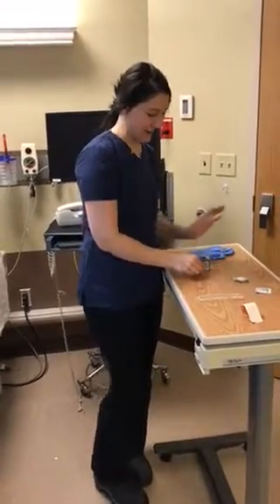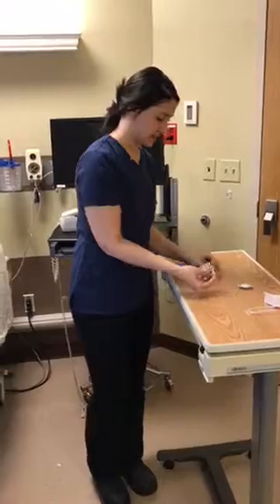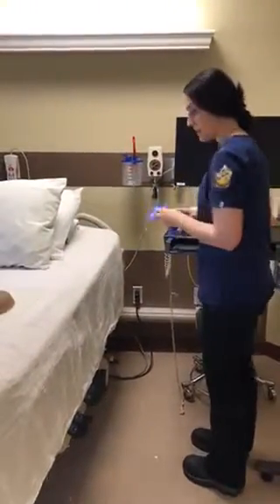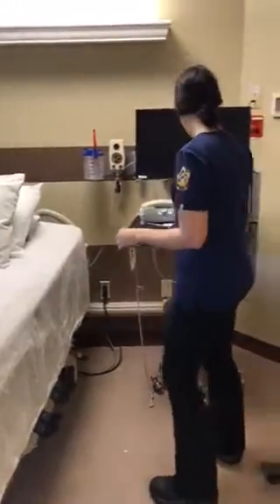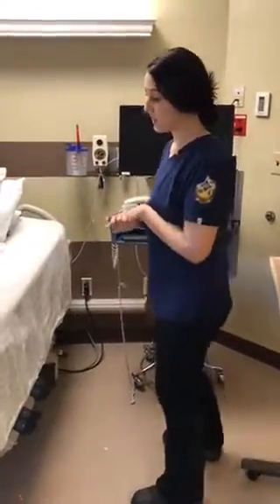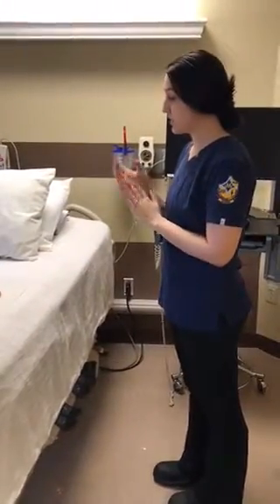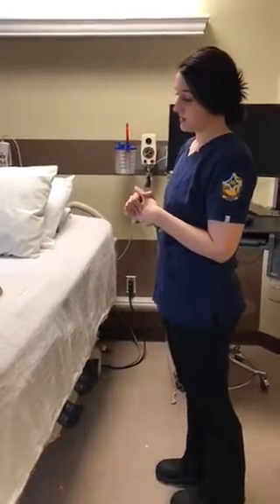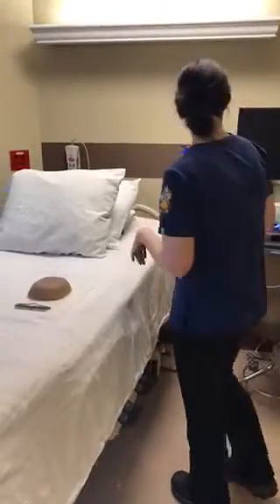Okay, so now that I have my draw complete, I'm going to get my supplies and go into my patient's room. Hi, Bob. How are you doing today? Okay. So, my name is Ashley. I'm your nurse today. I have an order from Dr. B to administer 10 units of U100 Humulin R insulin. And you remember what that's for? For the diabetes? Yep, we're trying to keep those sugars down. So that's what we're going to do today.